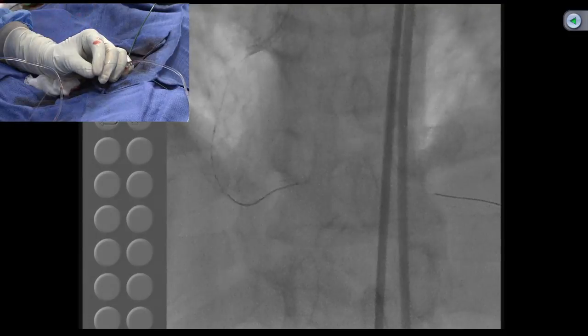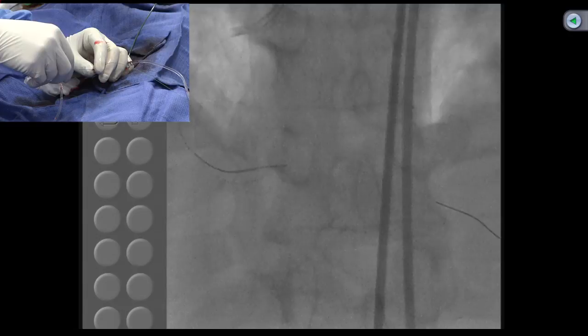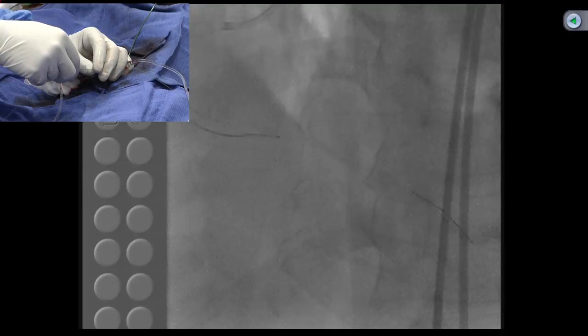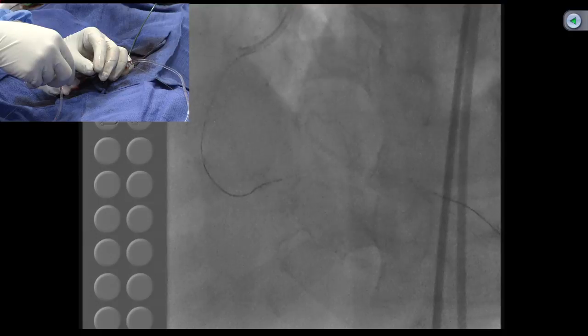Stop talking to the patient, give him sedation. Okay. You want to go to the left cranial? Yeah. Just a few more minutes. Giving you the dye. This is not a good wire.